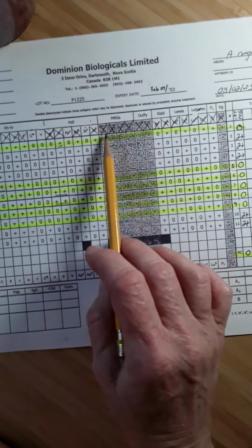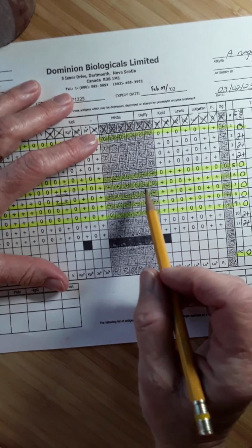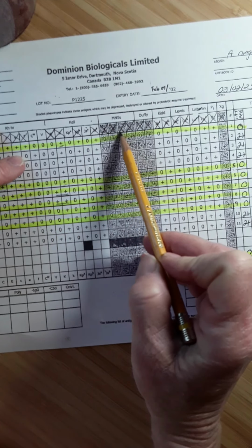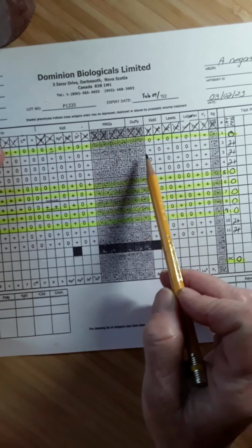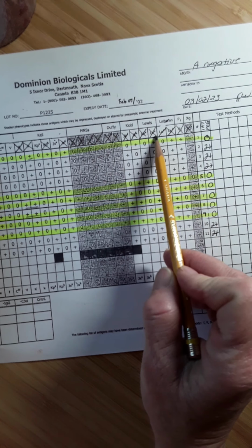In this section here, you have to be really careful because it's a little bit harder to see. So make sure that you can see your slashes. I've got M crossed out, N, big S, little s, FYA, and FYB. Over here in the Kidds, I've got them both crossed out. I've got both Lewis's crossed out.